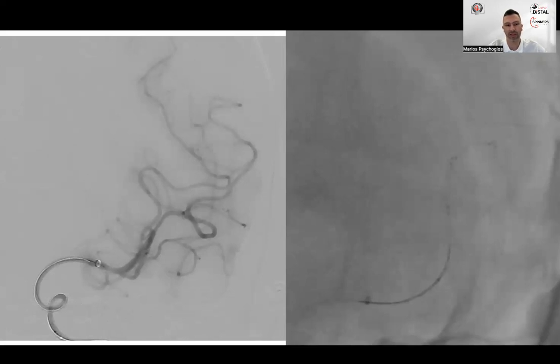If you know our SAVE technique about LVOs, you will probably think that it's similar to the SAVE technique. This is right. And if you are not acquainted with our SAVE technique, please click on the description below, and then you can see a detailed video of how we treat those large vessel occlusions. As you can see here, we have placed a small stent retriever primarily distally to the clot. This is where my microcatheter now is. Again, this is a small 6 French, 7 French aspiration catheter.